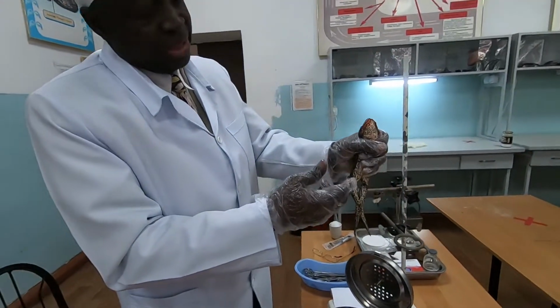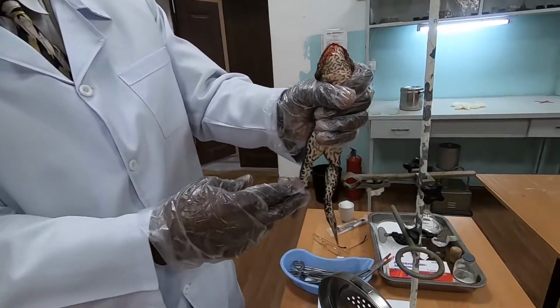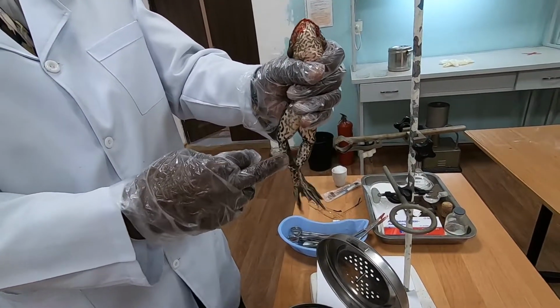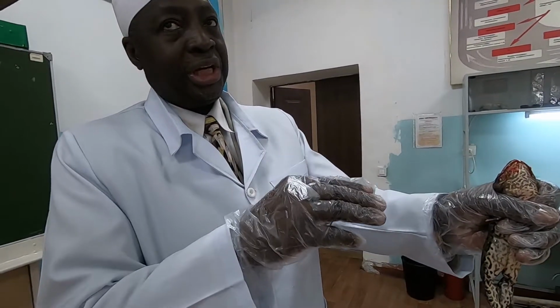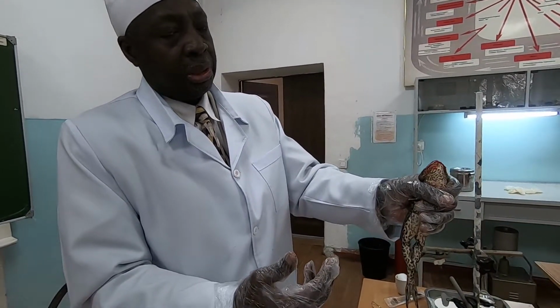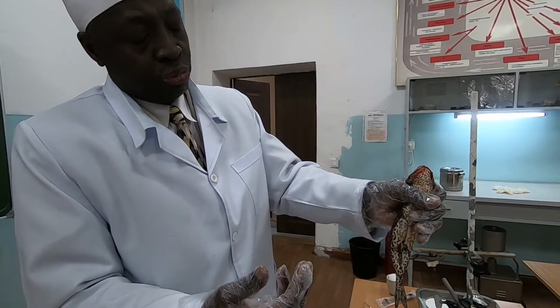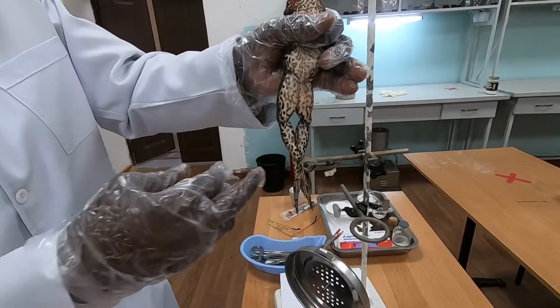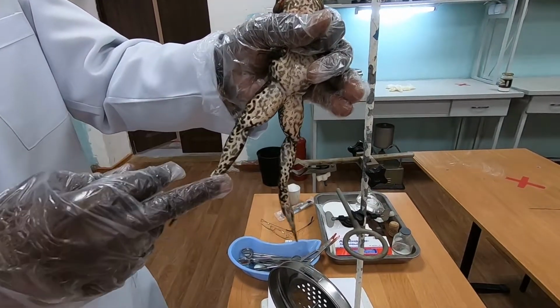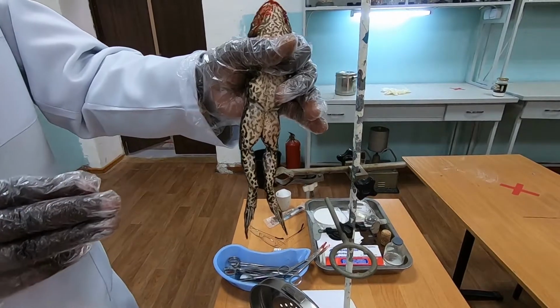So this is what is happening to the frog right now. The frog is in a shocking condition. So we leave it. After some few minutes, you will see it will begin to shake. It will regain its reflex back, okay? And then it will begin to shake. You will see it. Let's film it. You see, it's still in a shocking condition.